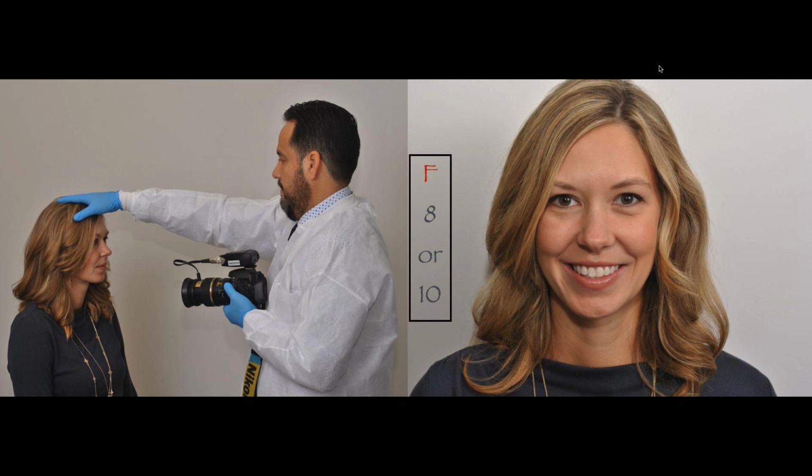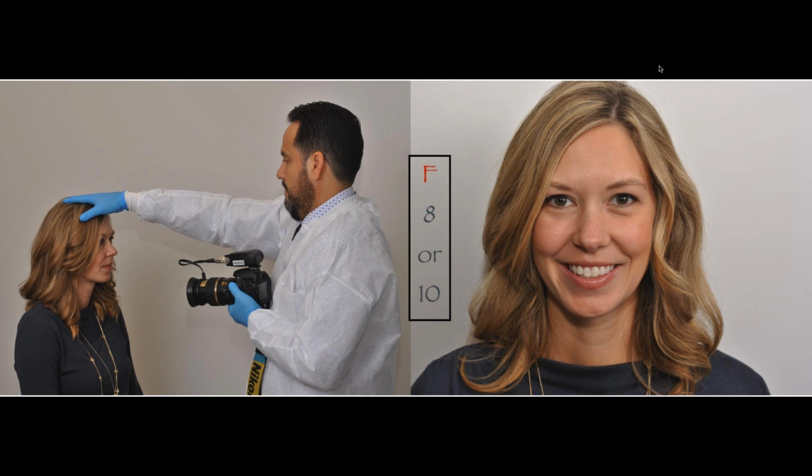And I'm actually extending my hand so that I can arrange the way that I want her to put her head, because normally patients will tend to tilt their head back, or down, excessively, and it's going to give you an image that is not the ideal image for your diagnosis. So you need to have the patient with the face fairly straight to the actual camera. So that's what I'm doing there.